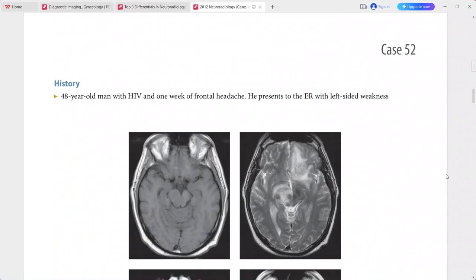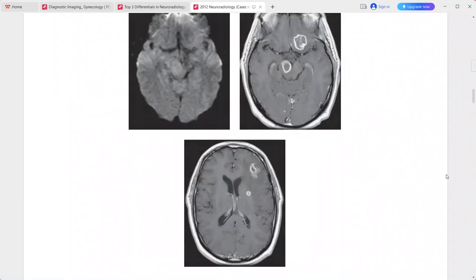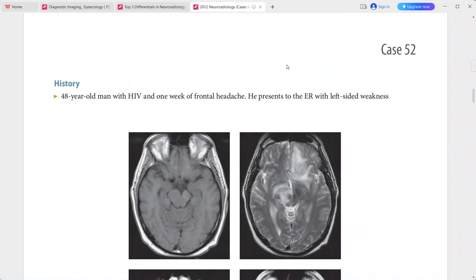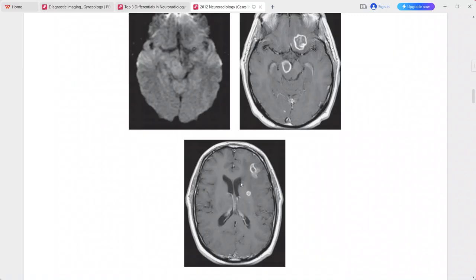Next: a 48-year-old man with HIV presenting with one week of frontal headache and left-sided weakness. Post-contrast sequences show several large rim-enhancing lesions in the cerebral hemispheres, midbrain, basal ganglia, and subcortical white matter.